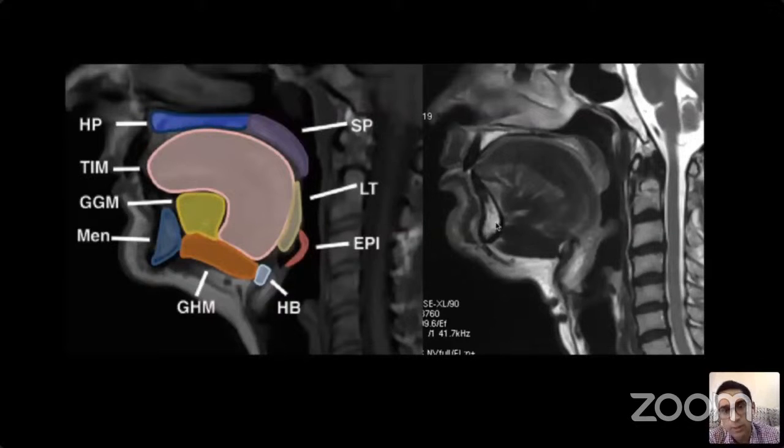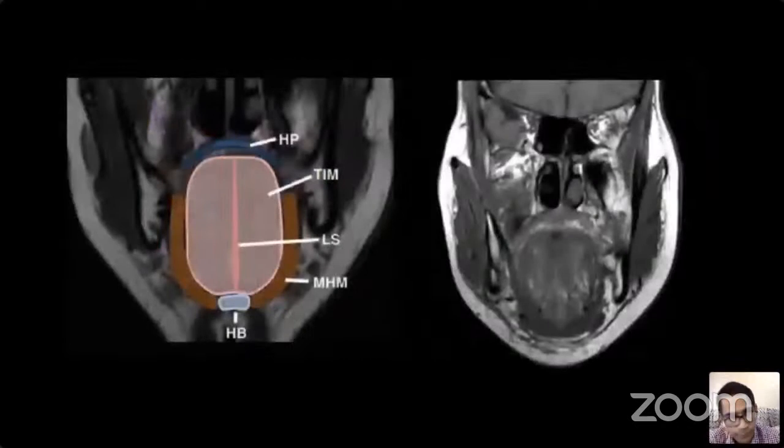There are two muscles which run horizontally from the genial tubercle to the hyoid bone. So this is the hyperintense signal of the marrow of the hyoid bone. This is the mandible, the genial tubercle over here. You see the genial tubercle is giving origin to the first muscle which is getting inserted into the hyoid, and this is the geniohyoid muscle. Inferior to the geniohyoid muscle, there is another linear muscle, which is the mylohyoid muscle. So this muscle forms the floor of the mouth. Any disease involving the mylohyoid or going beyond that is involvement of the floor of mouth.